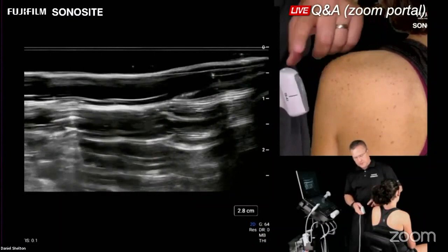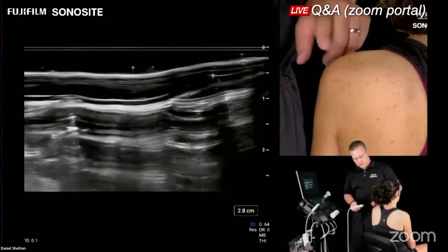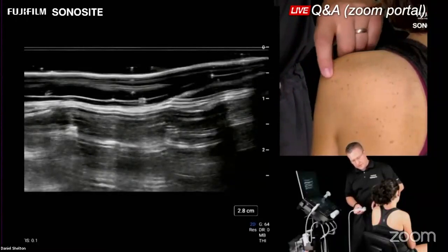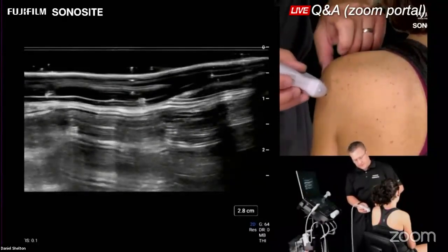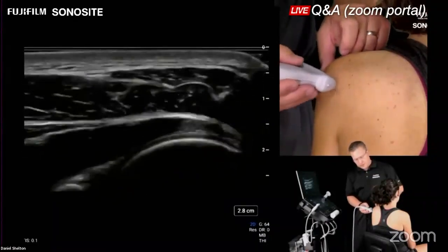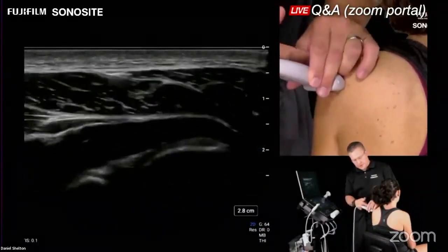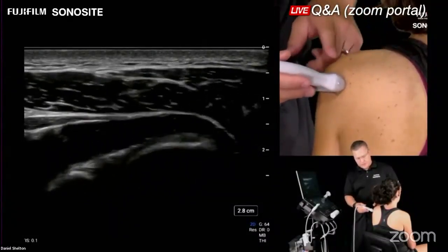I'm going to keep screen left medial for this exam. What I like to do is palpate that bony landmark, set the upper part of the probe, in long axis, across that lower edge of the acromion. So I'm actually physically bumping that up against the acromion. So I'm just going to set the transducer down right here. And then if you're already doing injections in a shoulder, the direction of your beam will be relatively exactly like you do a glenohumeral joint injection.